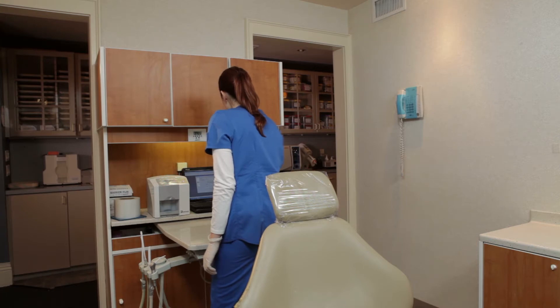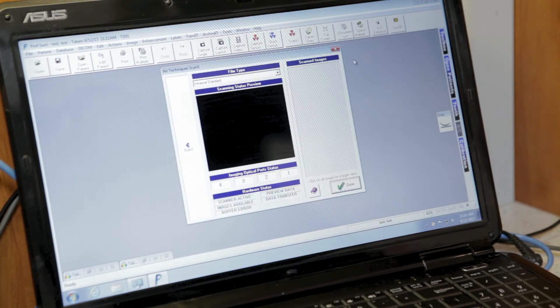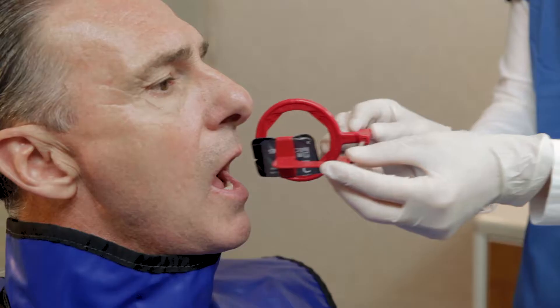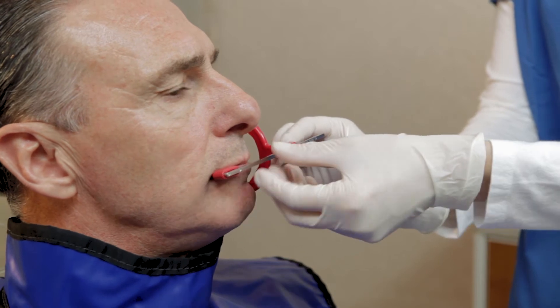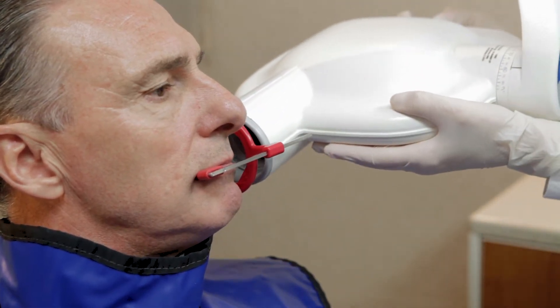Start the imaging software, selecting the patient and the desired resolution. Verify that both the Ready and Status LEDs are illuminated green. Place the sensor in the patient's mouth, as usual, using a standard positioning guide, as we are showing here, or a bitewing tab.